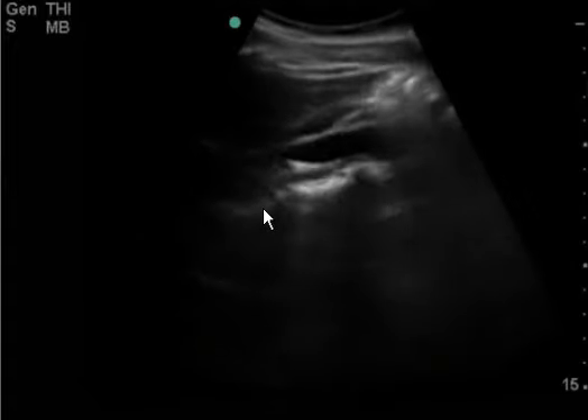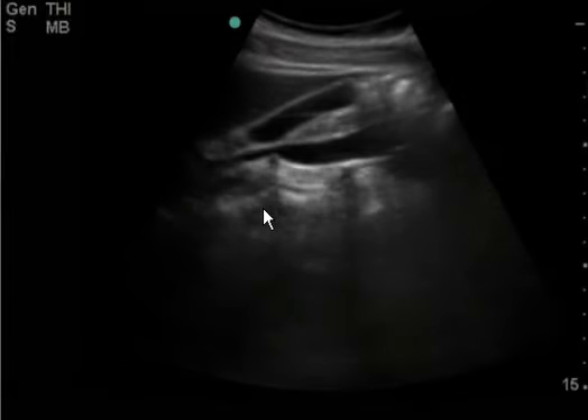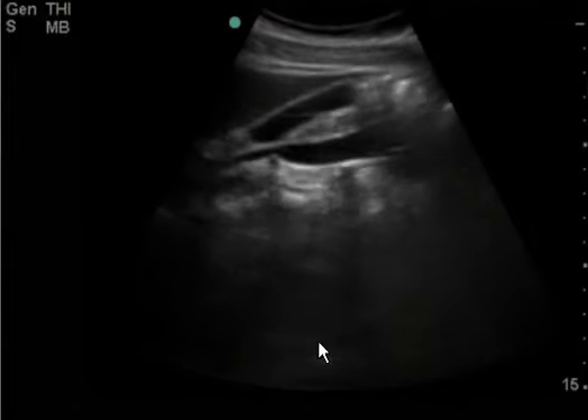I don't see any stones. I think you're pretty safe to say there's no stones based on the view saved. But next time I would consider decreasing your depth just so you can really focus on the area in question. I hope this helps. Thanks.